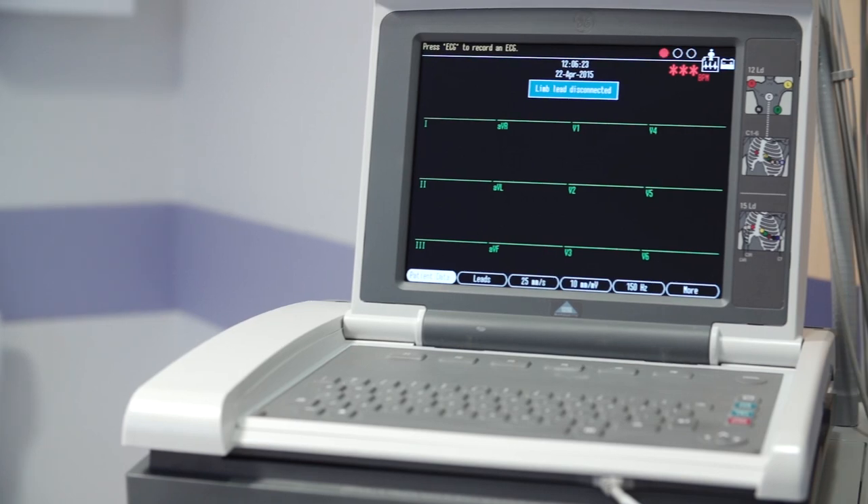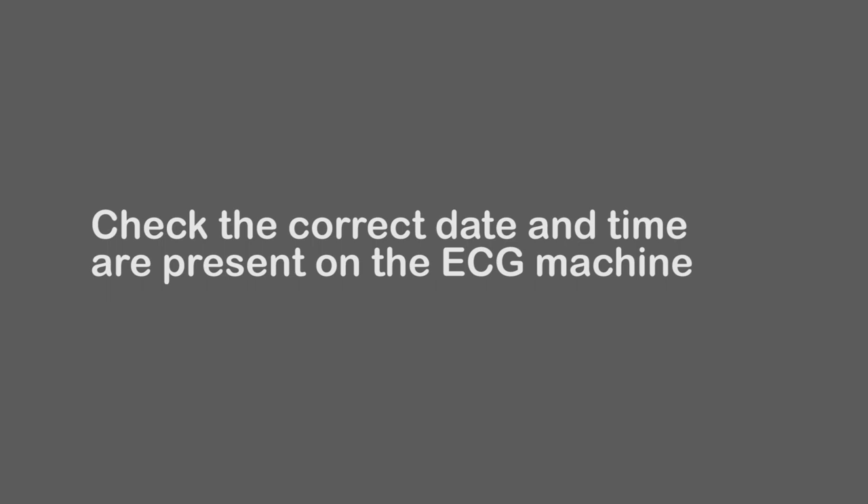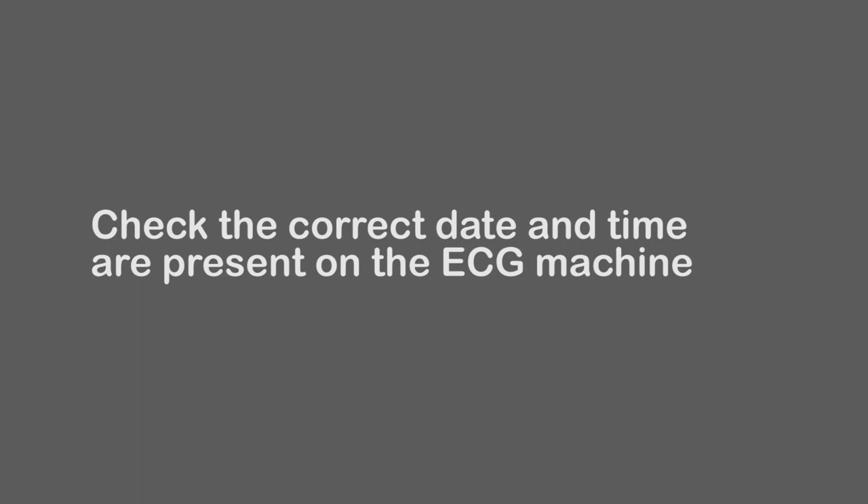The battery icon on the ECG machine shows what will happen when the battery is not fully charged. It is important that you check that the correct date and time is present on your ECG machine, and that you check the standard settings before you use it.